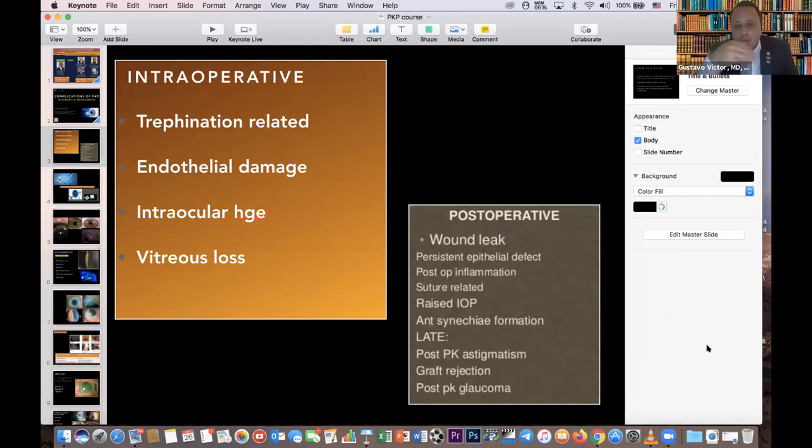Another way to do these steps in this sequence is to use a fiber optic from the vitrectomy machine, inside or outside the eye, to give more light. Then you can perform the cataract in the closed chamber, put in the foldable IOL, suture the incision, and then do the PK. So as you see, I prefer first a closed chamber phacoemulsification, close the incision and make the PK. If not possible, you go open sky, okay?